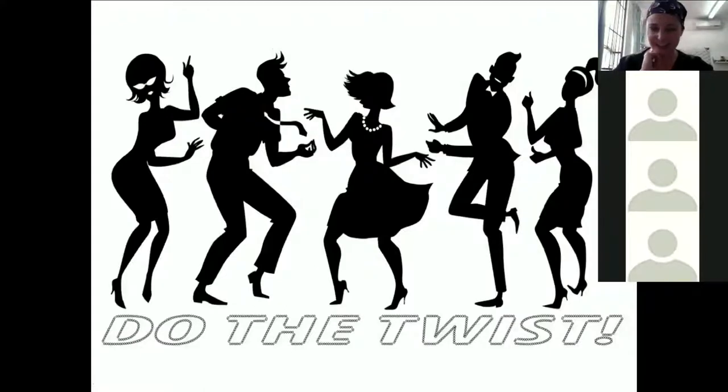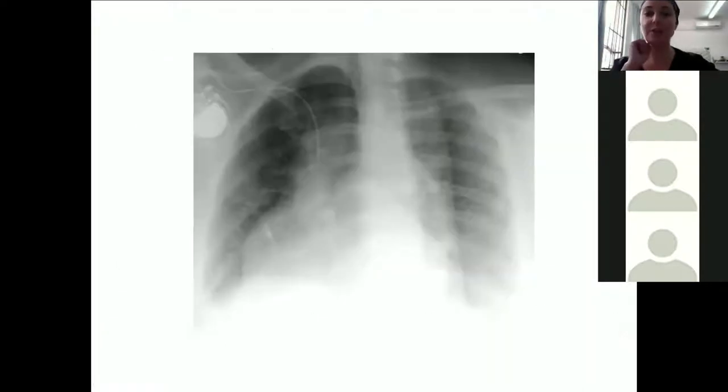Is the patient rotated? So when you have a look at the screen, is the patient standing straight on or have they moved a little bit one way or another? And has the x-ray been taken with a bit of rotation? So let's have a look at this one here. Do you think that's rotated or not?